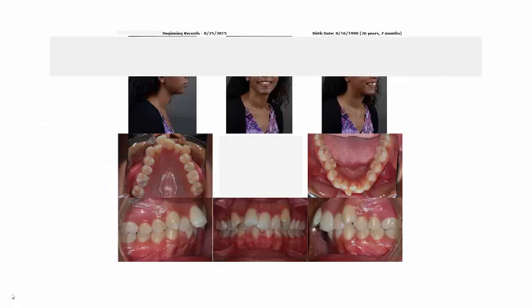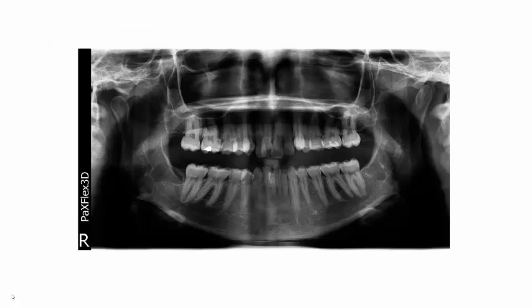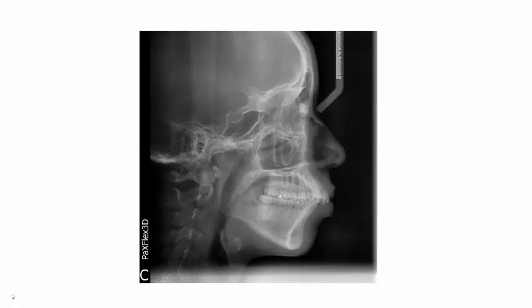This patient was transferred to us by another orthodontist. She had moved to our area, and these were her original photographs. You can see she's a Class II Division I with significant upper and lower crowding. Here's her panorex and her cephalometric x-ray. The treatment plan for this patient was the extraction of two upper first bicuspids to correct the overjet and obtain a Class I cuspid relationship, leaving the molars in a Class II position.